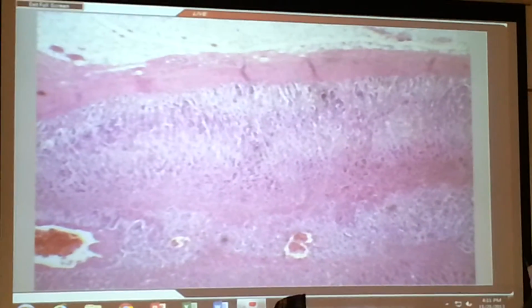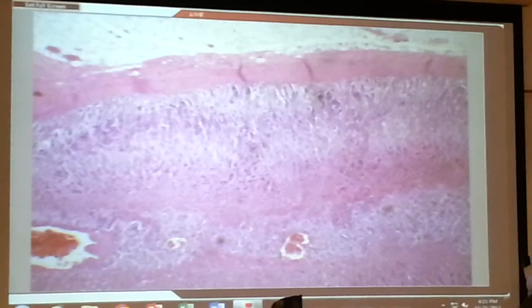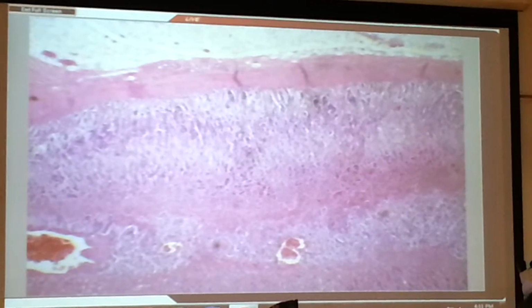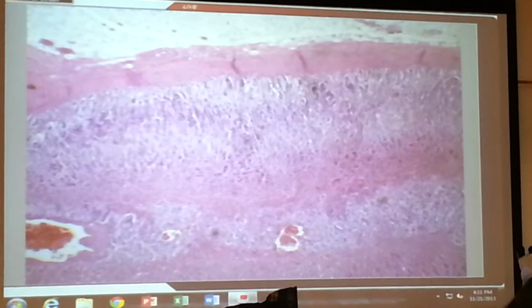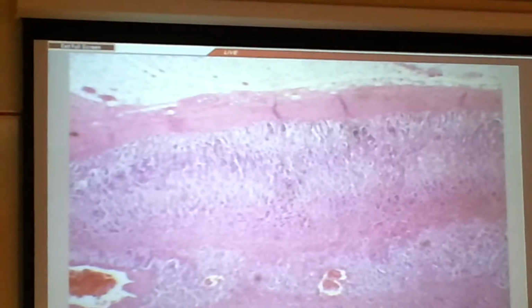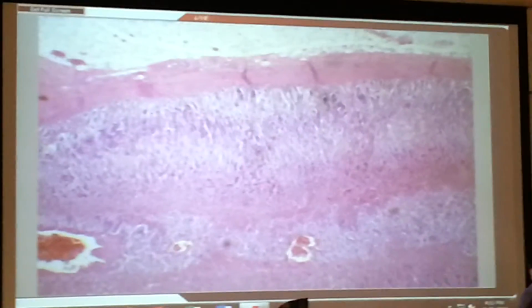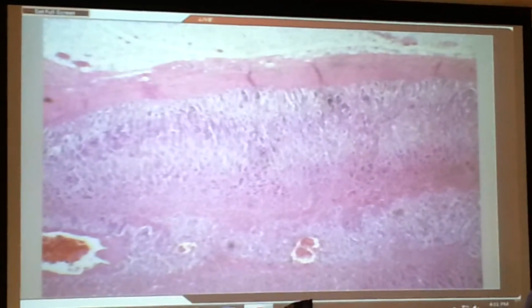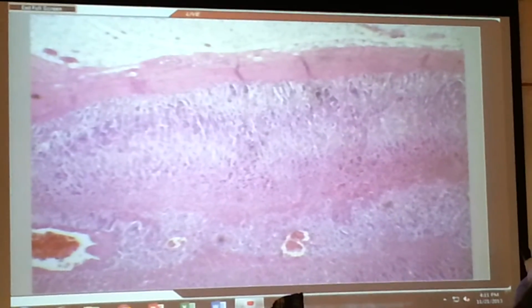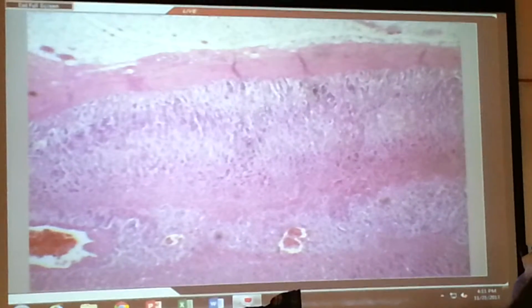The adrenal cortex is split into 3 layers. You can almost see them here. From here to there, about as thick as the capsule, that is zona glomerulosa. So zona glomerulosa is the outermost of these 3 layers. Zona glomerulosa is the part of the adrenal cortex touching the capsule. Now, it's about as thick as the capsule. That's a pretty good guesstimate there.